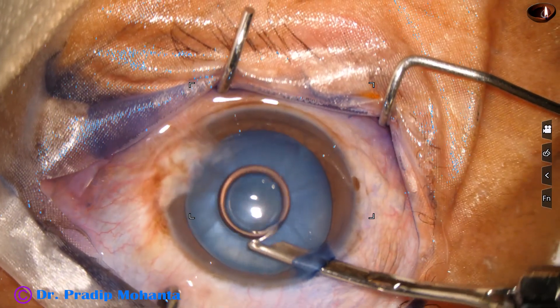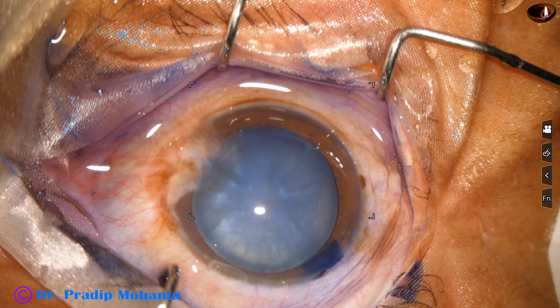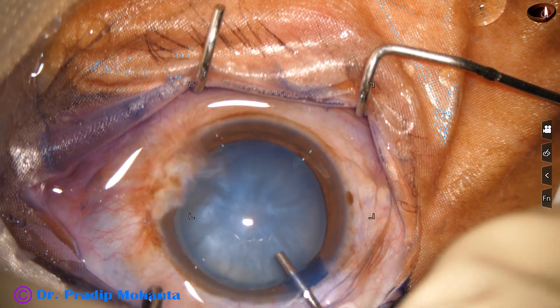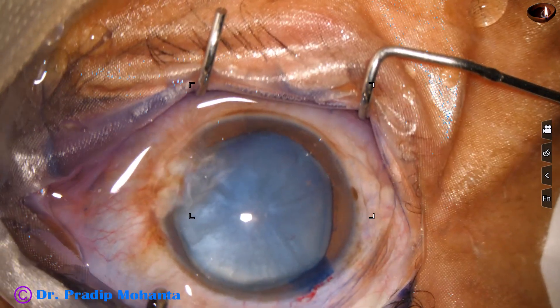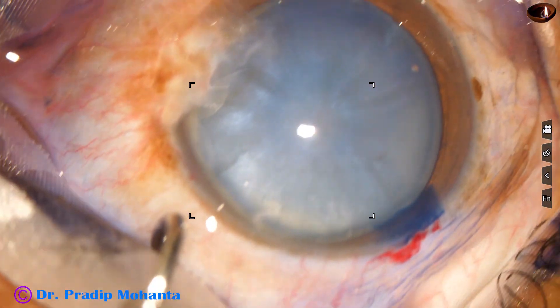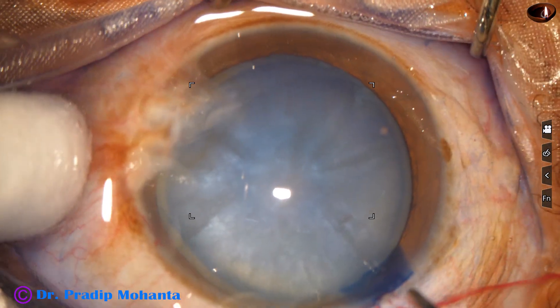This is a 23-gauge Simcoe cannula. Now the anterior chamber is filled with a viscoelastic substance — this is 2% hydroxypropyl methyl cellulose. I always use only methyl cellulose for intumescent cataracts. I don't use sodium hyaluronate or chondroitin sulfate.